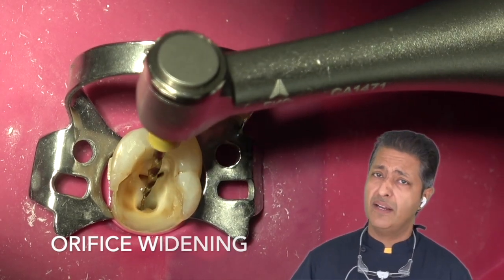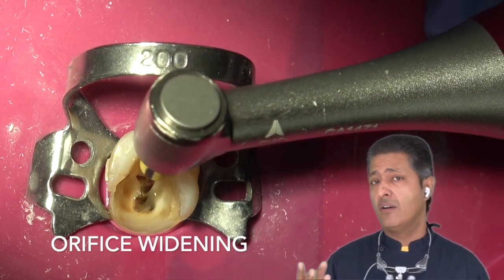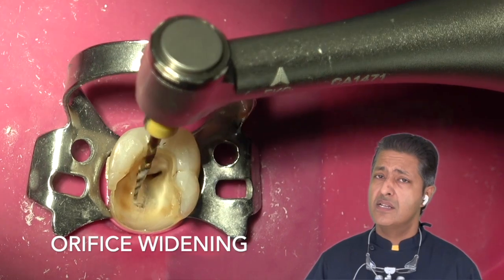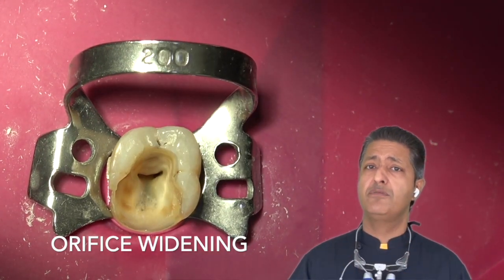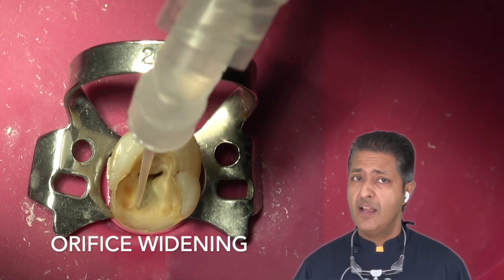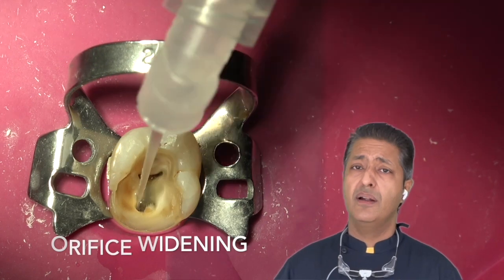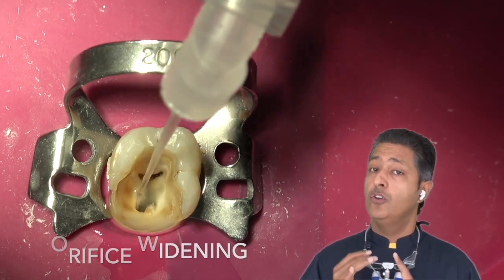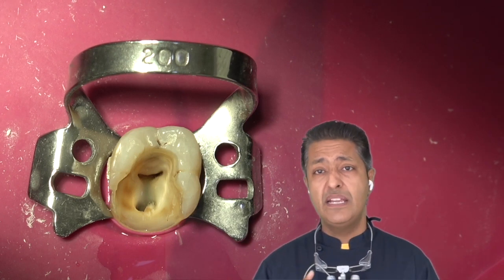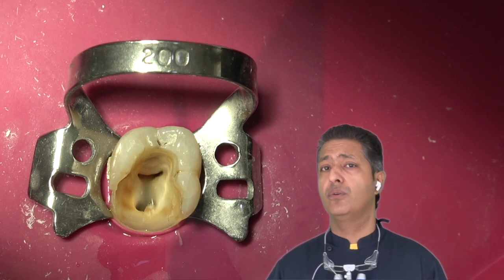if we are using rotary endodontic files, then every file system comes with an orifice shaper, or if you may call it an orifice widener. What we have to do is we have to just fill the pulp chamber with an irrigant, never ever work in a dry canal. And you can see here that I just used the orifice shaper. The intention is not to take this file till the working length. Please do not take this file to the working length, because it is not meant to do that.